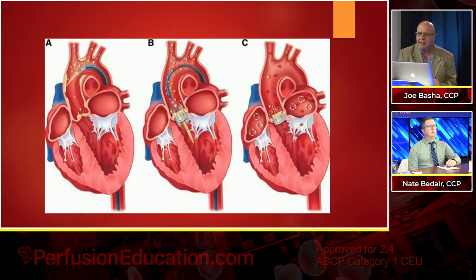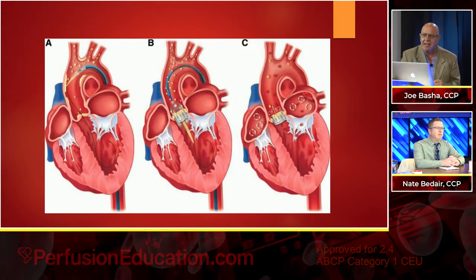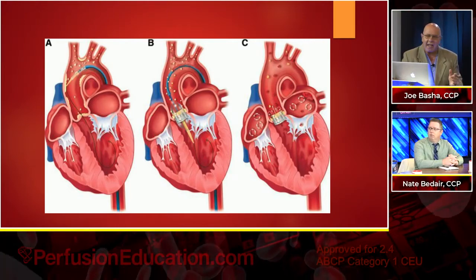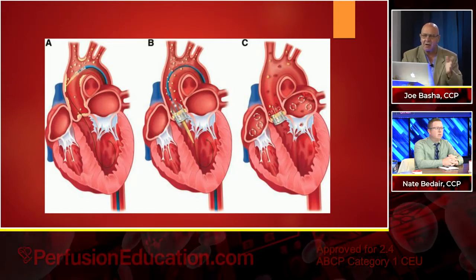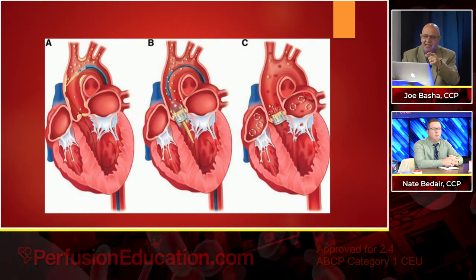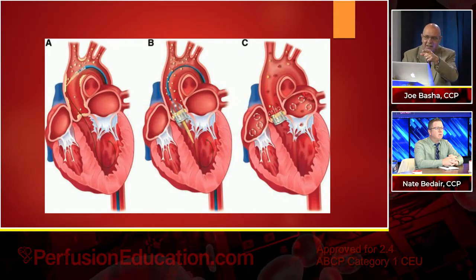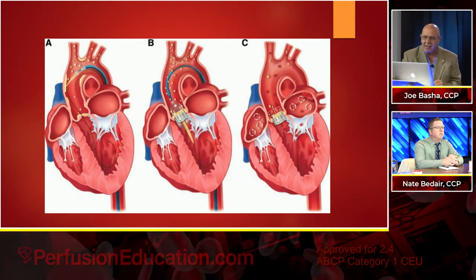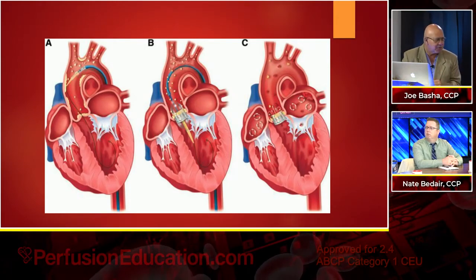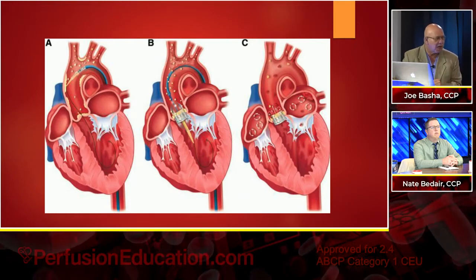Okay, so what's the reality? Well, the reality is, as that thing is going up the aorta and starting to make that turn around the arch, it's banging against that superior wall of the aorta. And it's breaking off pieces of atheroma, calcification, tissue, whatever else is getting knocked off as it comes around. You can see it on the lateral aspect of the aorta down by the sinotubular junction. You can see it, I'm sure, right there in A. Then as you're passing it through and dilating the valve to implant it, you have another massive shower. And then as you take it out and it just sits there for a little while, there's still going to be some residual showering.